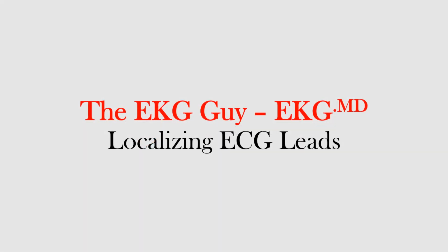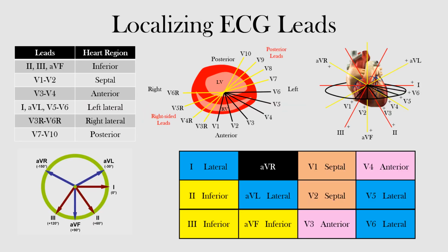In this lecture, we will discuss how the ECG leads are able to localize different regions of the heart and where those regions are located on the standard 12-lead ECG. I wanted to take a lecture to review what we've learned so that you are starting to connect everything. More specifically, I want you to keep in mind the leads on the EKG that correspond to specific regions of the heart. First, let's go over the limb and precordial leads.